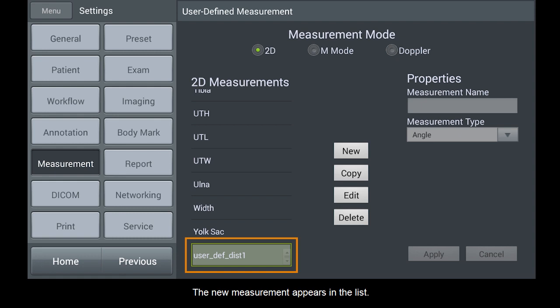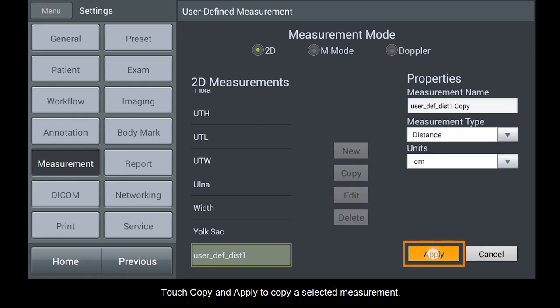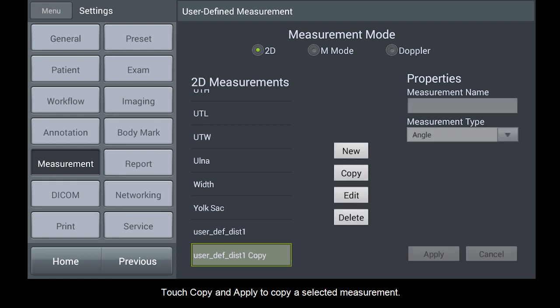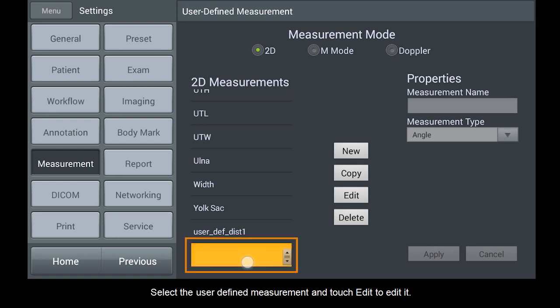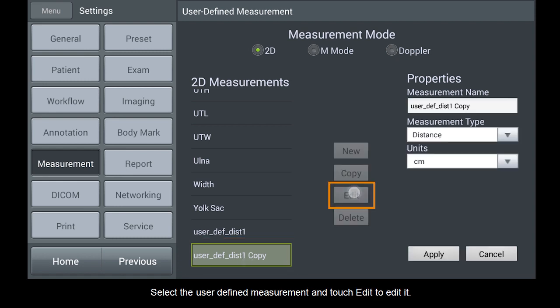The new measurement appears in the list. Touch Copy and Apply to copy a selected measurement. Select the user defined measurement and touch Edit to edit it.